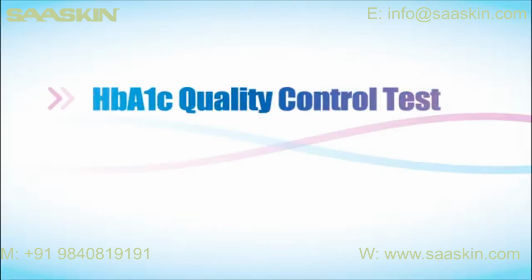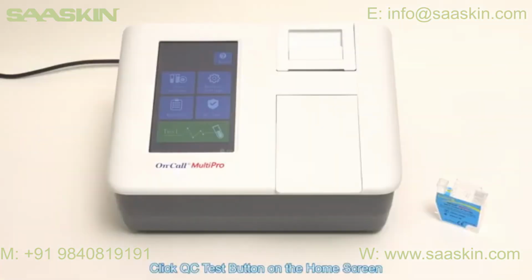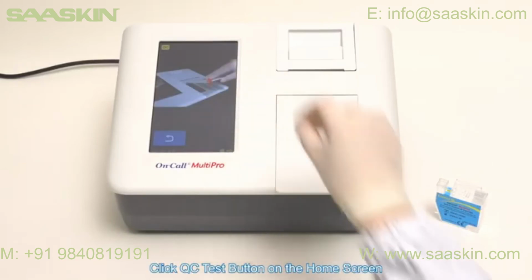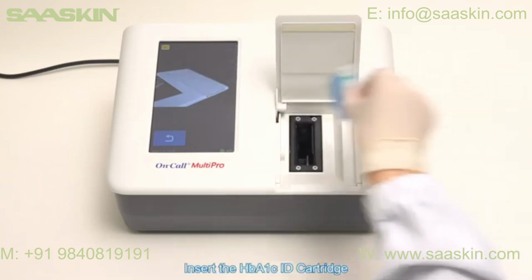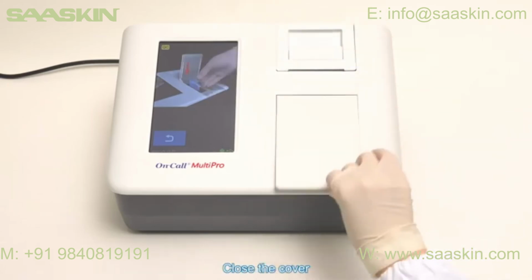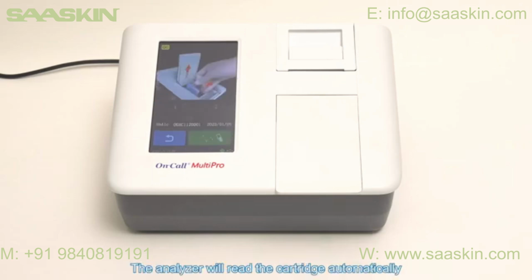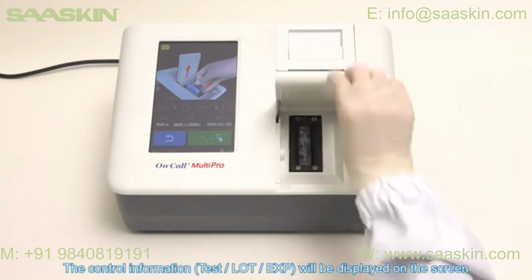HbA1c Quality Control Test. Performing QC test with HbA1c Individual Control Device. Click QC Test button on the home screen. Open the cover. Insert the HbA1c ID cartridge into the cartridge compartment with label facing left. Close the cover. The analyzer will read the cartridge automatically. The control information, test, LOT, EXP, will be displayed on the screen.